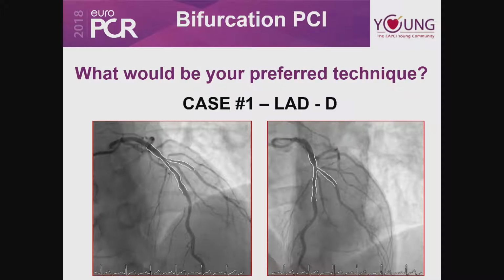Okay, so considering what was just mentioned by Professor Marco, the catheter is 2 millimeters. So what is the size of the side branch? Who says 2.5? Who says bigger? Okay, but do you think you can perfectly evaluate this based on this angiogram? Someone hesitated.